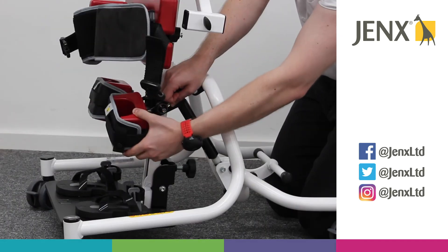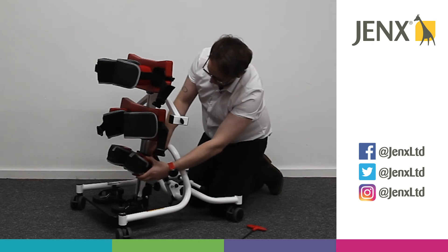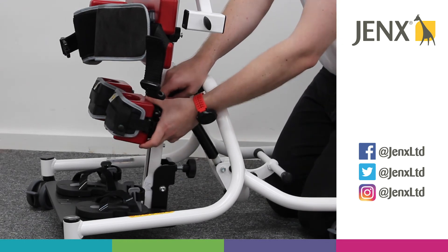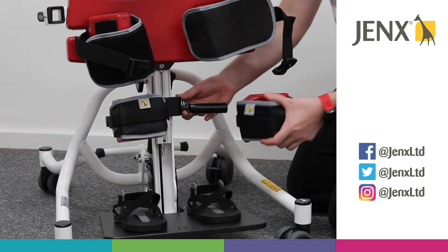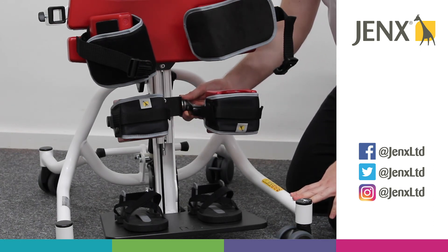We've also got adjustment left and right as well for any irregular positions. If we find that the knee cups are too close together, or if we want them a little bit further apart, you are able to take the knee cup off and then if we put it the other way around, we're able to get a further distance between the knees.